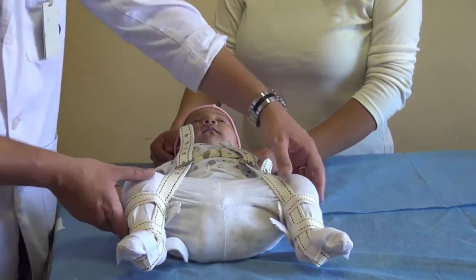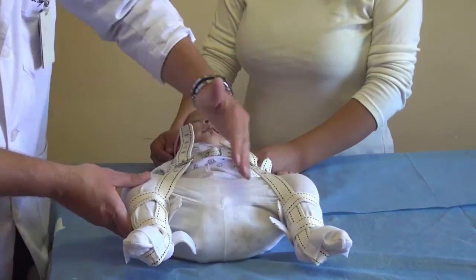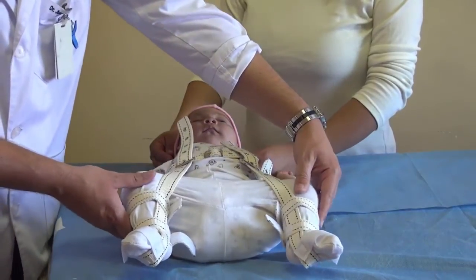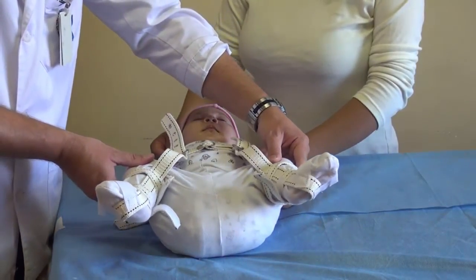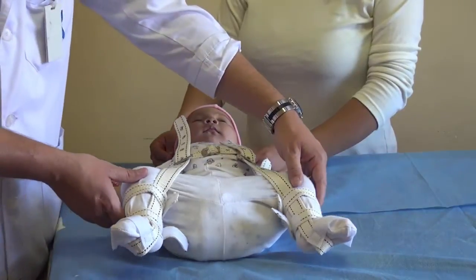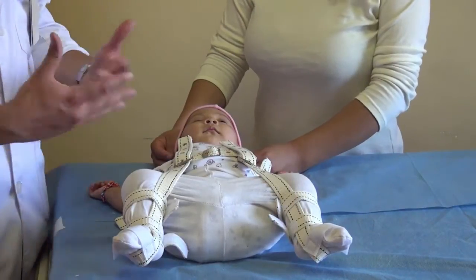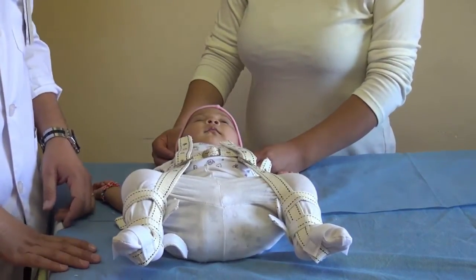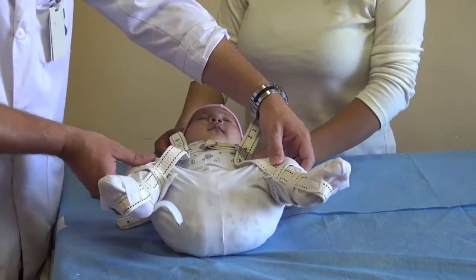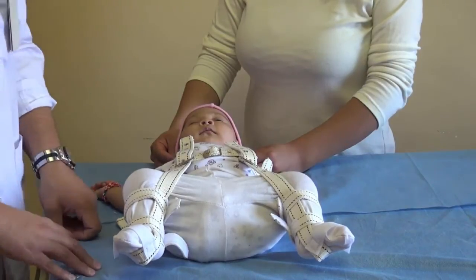Another important thing is that the hips and the thighs must form a 90-degree angle with the baby's body. If the flexion is too much, first of all it's not comfortable for the baby, and second we might damage the hip — we might cause necrosis of the hip, so we have to be careful. We tell the parents that if the baby grows between controls and the mother notices the knees are way up, to come in before the next appointment so we can rearrange the harness.